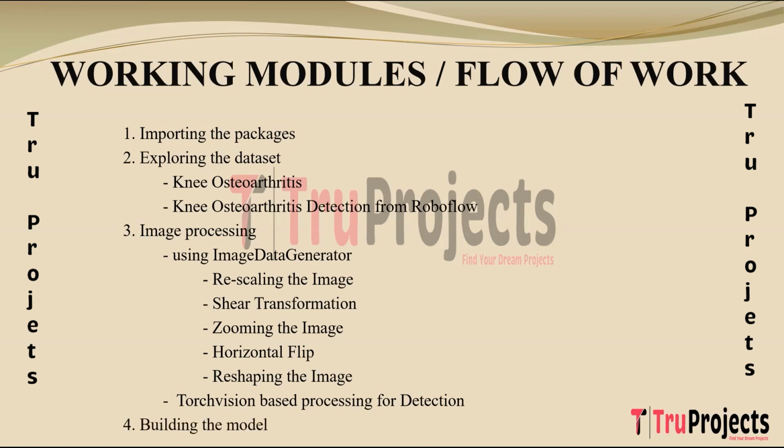Building the model. This phase involves constructing the improved CenterNet model architecture enhanced with a pixel-wise voting scheme for knee osteoarthritis detection. Customized CenterNet architecture, utilizing a modified or enhanced version of the CenterNet architecture tailored for precise detection of KOA within knee X-ray images. Pixel-wise voting scheme, integrating a voting mechanism at the pixel level, which involves aggregating predictions across neighboring pixels or regions to enhance accuracy in identifying areas indicative of knee osteoarthritis.